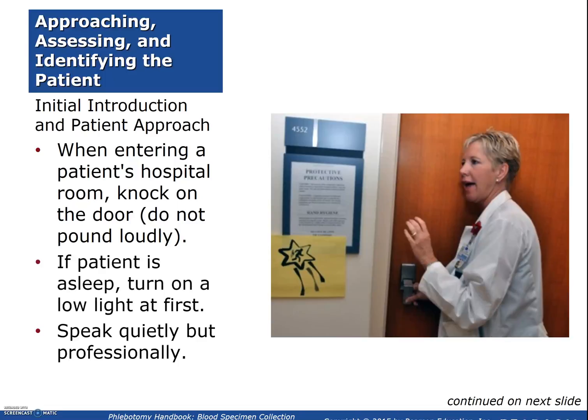When entering the patient's hospital room, I'm going to knock on the door. Do not pound loudly. The patient is asleep. Turn on the low light at first and speak quietly but professionally.